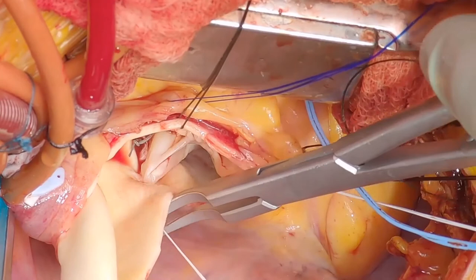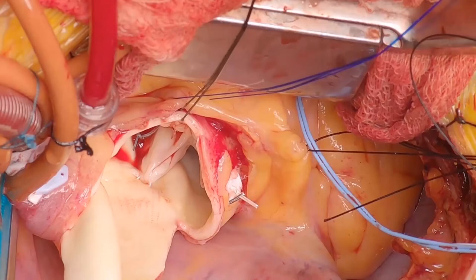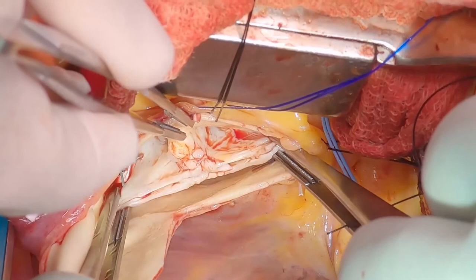We make sure it's looking good and symmetrical. If there is any thickening of the non-coronary leaflet, I will either shim that or crush that area so it folds more well into the leaflet that has been sewn together. There's a bit of thickening on that leaflet, so I'm going to soften that up so it approximates better with the other leaflet. And there you have a nice symmetrical repair that should work very nicely.